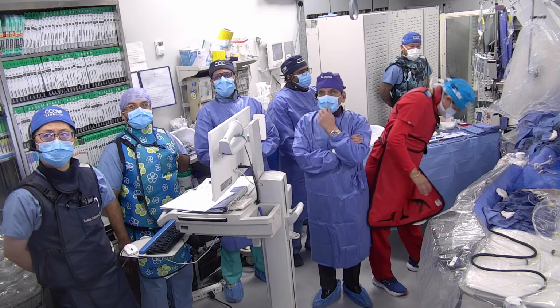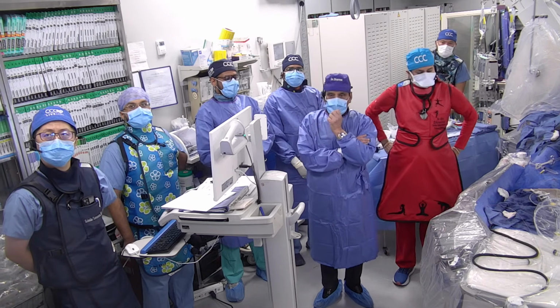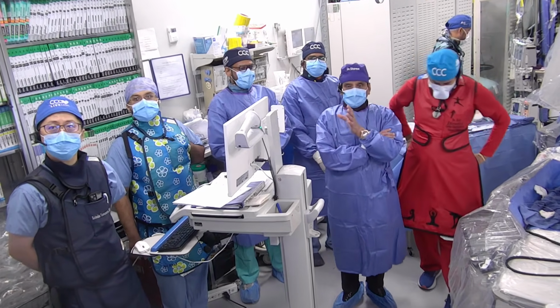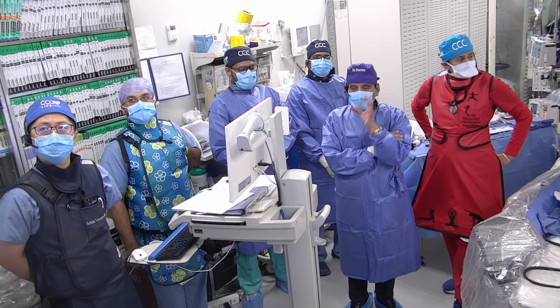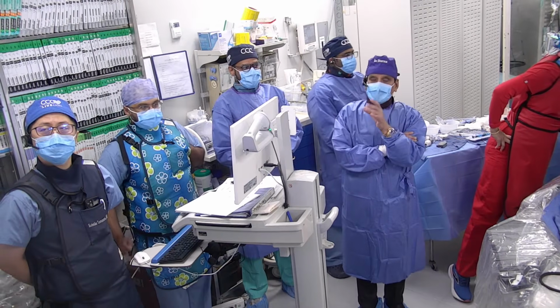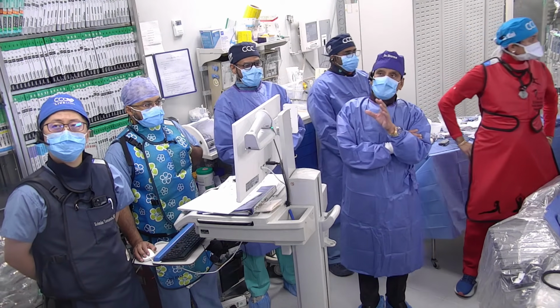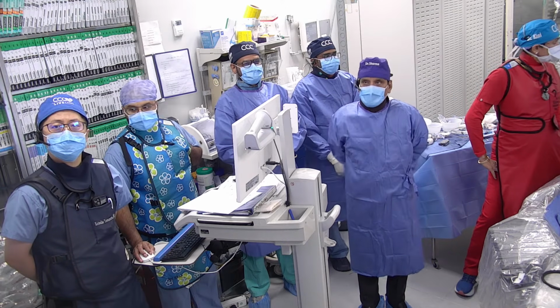Now, not every case of stent deformation will create trouble, but the key is that in the long run, maybe not 1 year, which are the data, 1 to 2 years, maybe in 5 years. The data are that almost 1 in 7 cases, when we rewire and do the bifurcation, we go through underneath the struts or in between the struts, which is a very common finding.